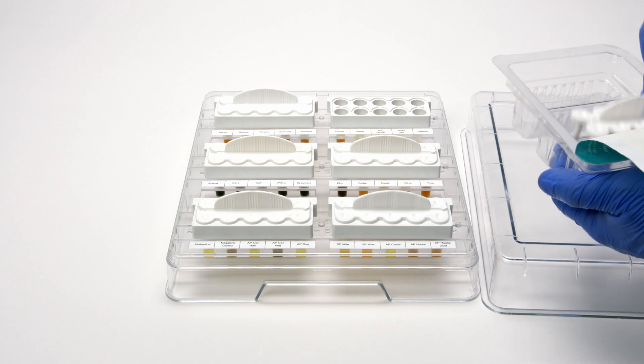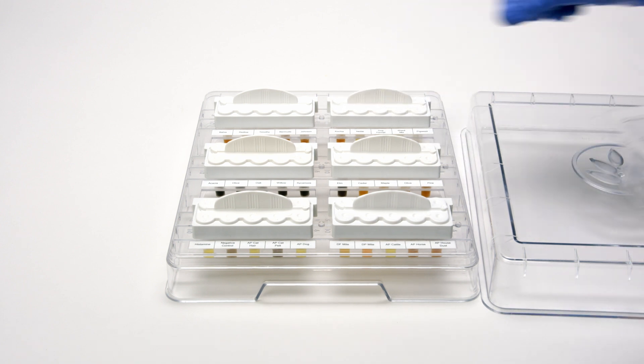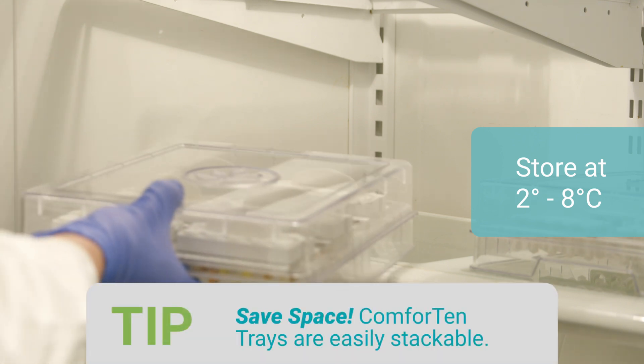Once a patient's test session has been completed, place new Comforten or Quintip devices in the filled extract tray. Cover and store at 2 to 8 degrees Celsius until the next test session.